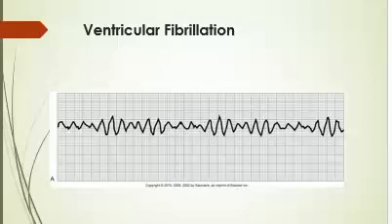And it is up to you to be able to identify this rhythm. So at the level that we are at, about to become registered nurses or even licensed LPN, we need to know what to do when we see this rhythm. We need to know what to do when we see VTAC. We need to know what to monitor when our patient has a 1st degree AV block. We need to anticipate what the doctor's going to be ordering if our patient converts to atrial fibrillation. We need to know what to prepare our patient for if they're in a complete heart block.